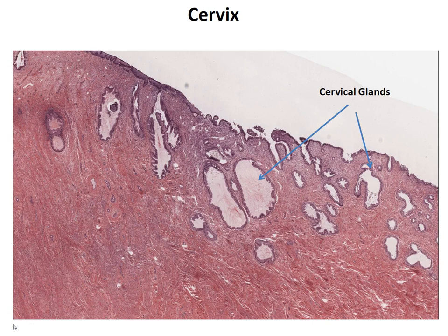Here's a section through the cervix. Now, on your left-hand side, you can see stratified squamous epithelium of the ectocervix, while on the right is the simple columnar epithelium of the cervical canal or endocervix. Note the abrupt change or transition from a stratified squamous epithelium to a simple columnar epithelium. Large glands or cervical glands are present and some are branched.